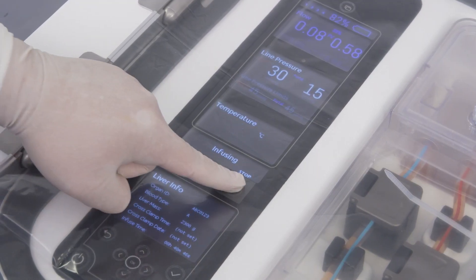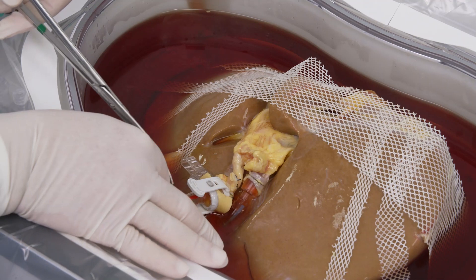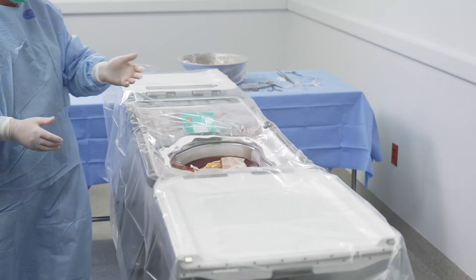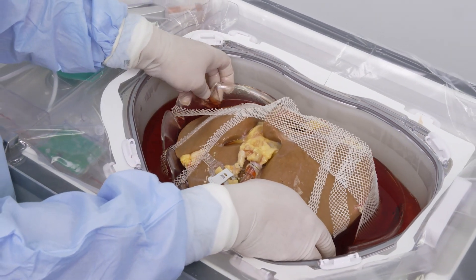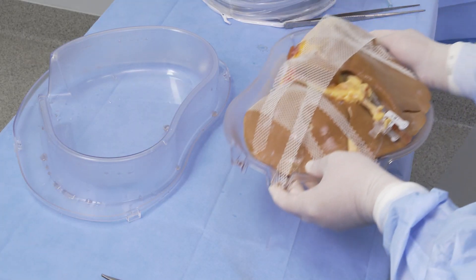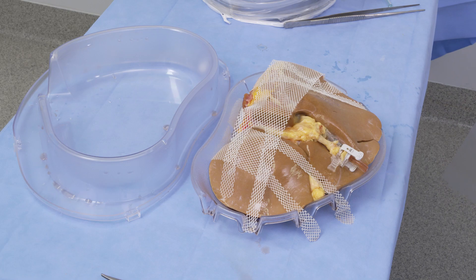Press STOP on Lifeport liver transporter. Disconnect or cut the infused lines. Lift the liver cradle with the liver from the organ chamber and transfer to the sterile field. Unhook the mesh organ restraints and remove the cannulas from the vasculature.